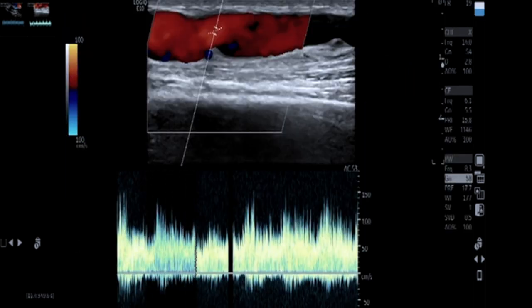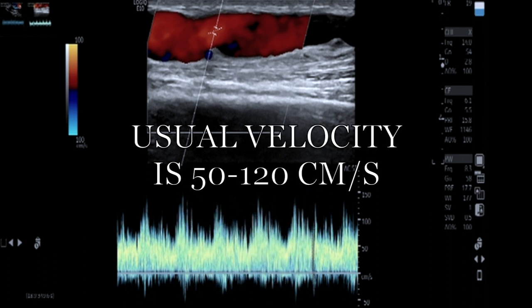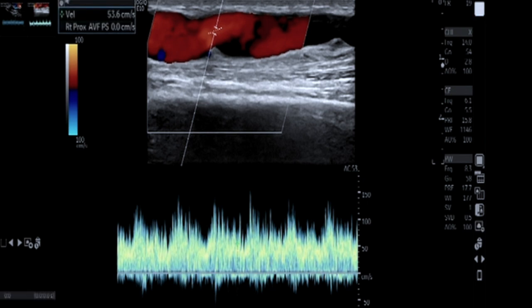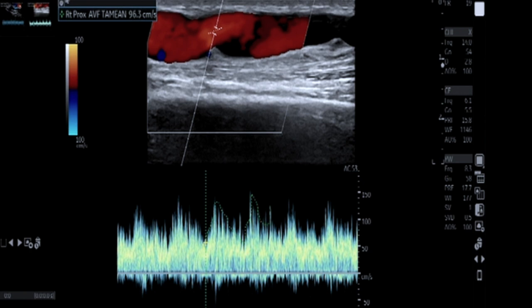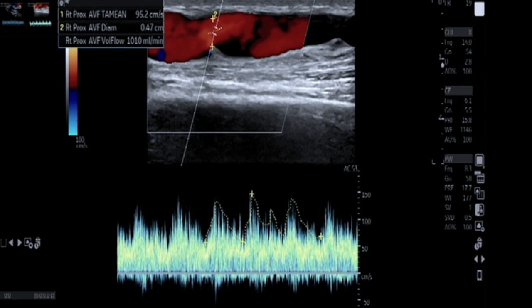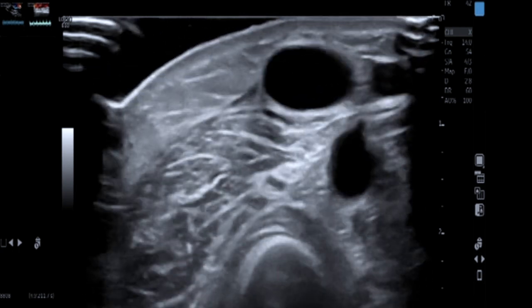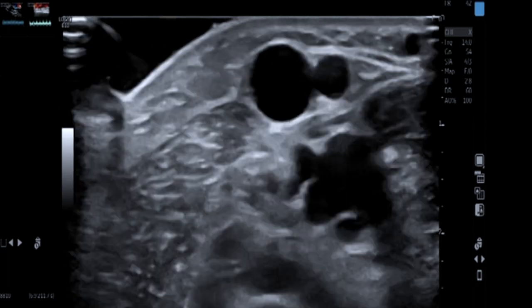The velocities of the draining vein are around 150 cm/s — draining veins usually have velocities of around 50 to 120, so 150 is slightly on the higher side. For volume flow measurement, select three to four cardiac cycles manually and measure the vessel diameter at the site of sampling. A volume flow of around 1000 ml per minute is calculated here, which is good enough for adequate dialysis. This is practically a functioning fistula with some acceptable aneurysmal dilatation.